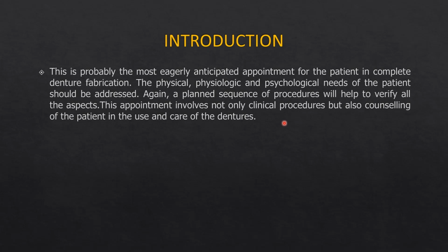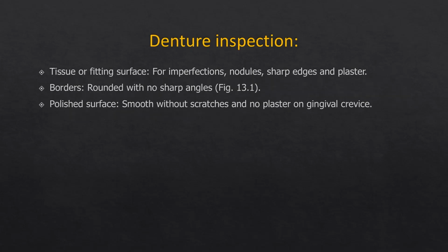Every process has a lot of psychological and social impact on the patient, and if done properly, it can really help, benefit, improve and enrich the quality of life of the patient. So this step is really important. So next, coming to the denture inspection.